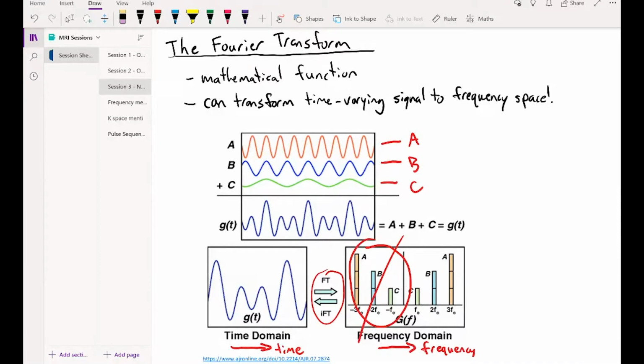And the second one is that once we introduce phase to the Fourier transform, we need to start considering complex numbers, because each of these functions, the green, blue, and orange lines in frequency space, is then represented not just by amplitude, but by a complex number with a real and imaginary part. And that, again, is just getting a bit too far into the math for the purposes of this course. It is all explainable, and I hope that skipping that information isn't confusing anybody, but it does get a lot more complex when we start considering phase information as well.